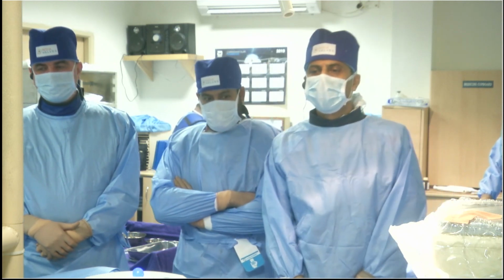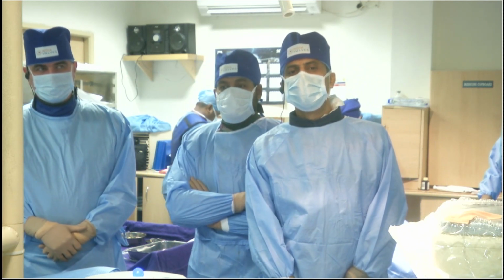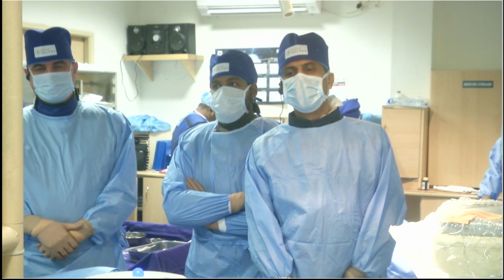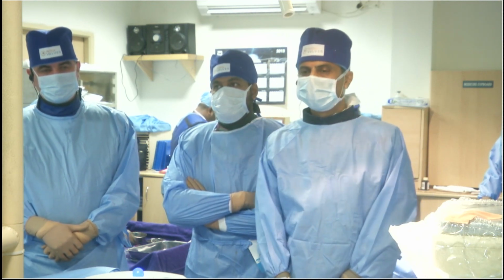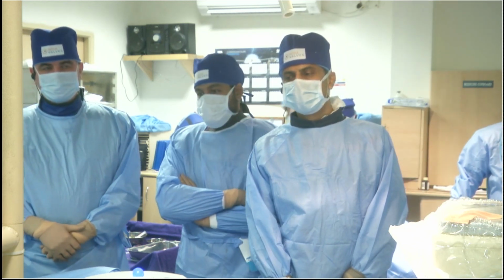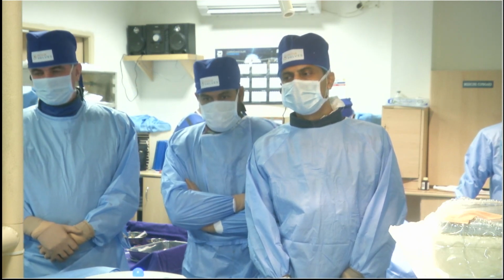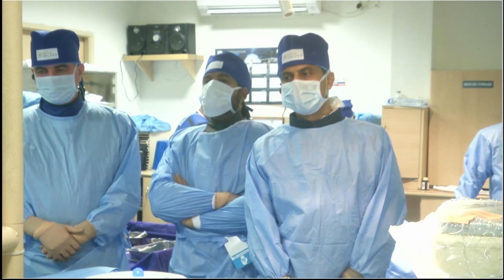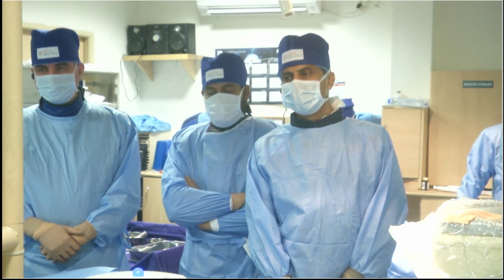And this slide shows the iliofemoral axis. Both sides of the iliofemoral axis are good size, and the height of the bifurcation of the femoral artery is low enough. This is the coronary angiogram. So we don't see severe coronary stenosis. So what is the plan? This is a demonstration. Okay, thank you very much, Kentaro.